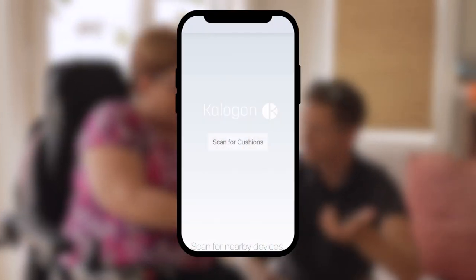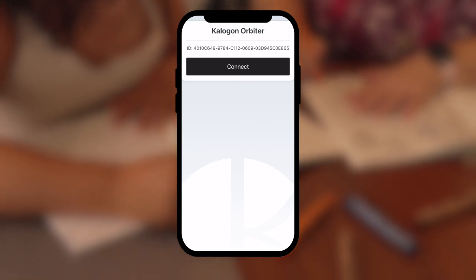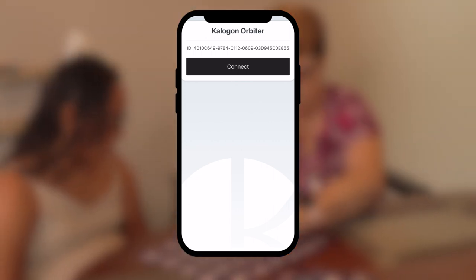Download the Kalogon app on your mobile device. Power on your control unit. On your mobile device, select scan for cushions. You will see your control unit number appear on the screen. Select your control unit by clicking on it.